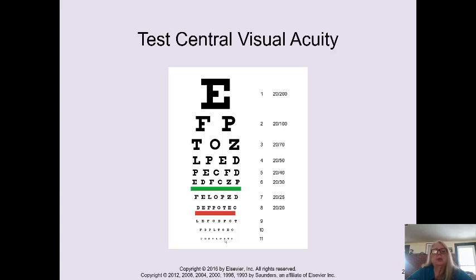And then your patient will read the smallest letters that he or she can read, with fewer than, I think it's 2 mistakes, we'll learn that here in a second, you might already know. And given that information, that's what will determine the second number over here.